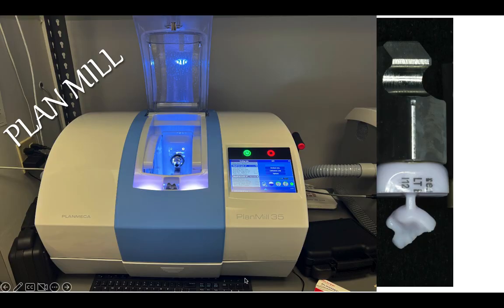Well, so this is the Plan Mill. This is new. We just received this one a week or 2 weeks ago. And as you can see here, you have a square, diamond, rhomboid shape. This is for the rhomboid shape of the blocks. So this is pretty much for e.max in this case.